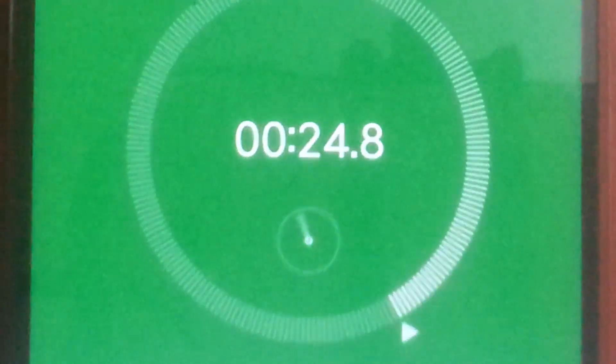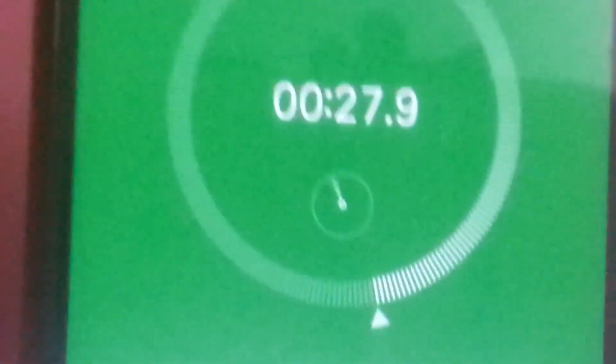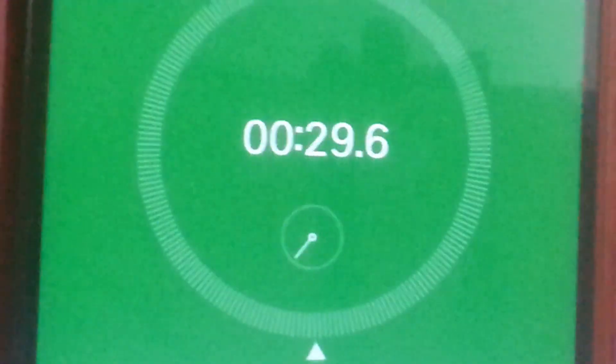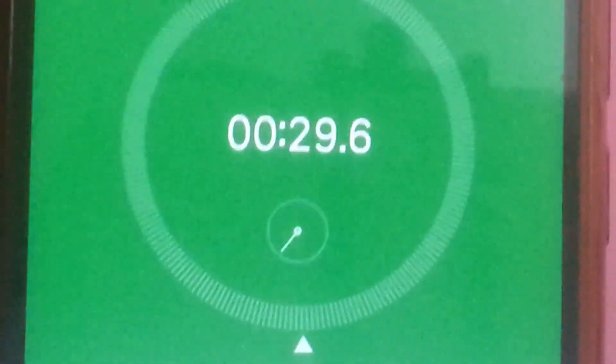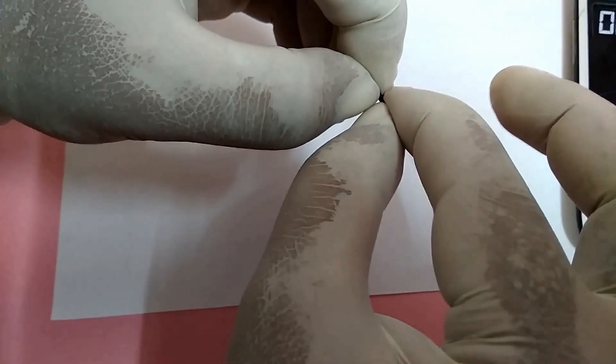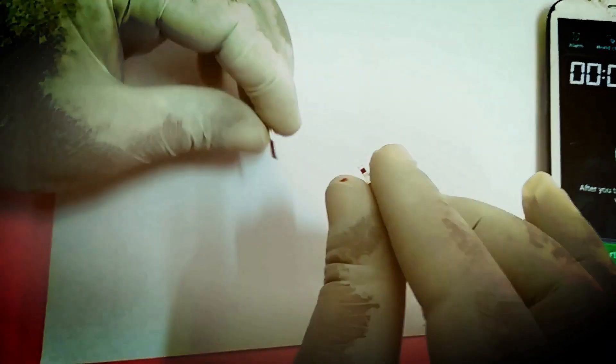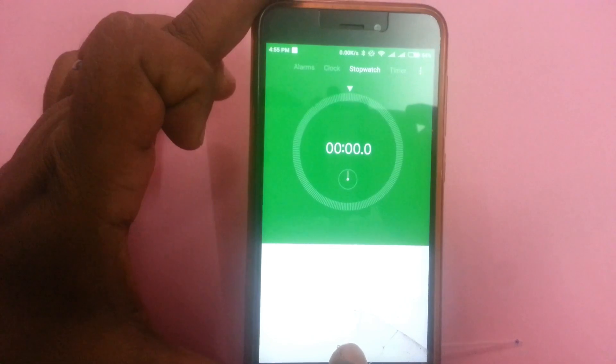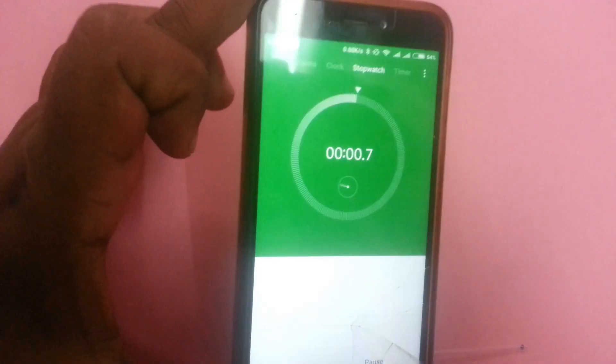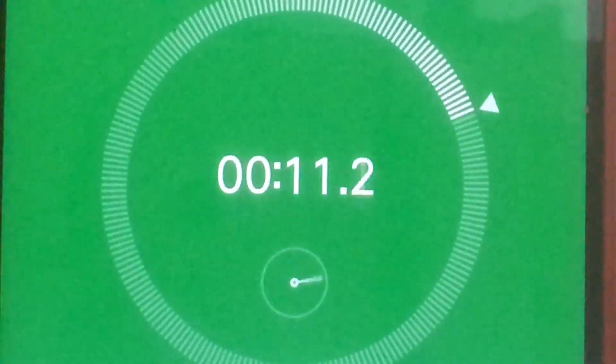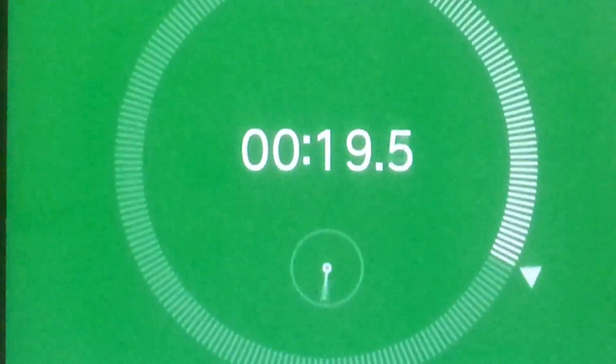30 seconds of time intervals. The time at which a thread-like structure appears, that will be the blood clotting time.